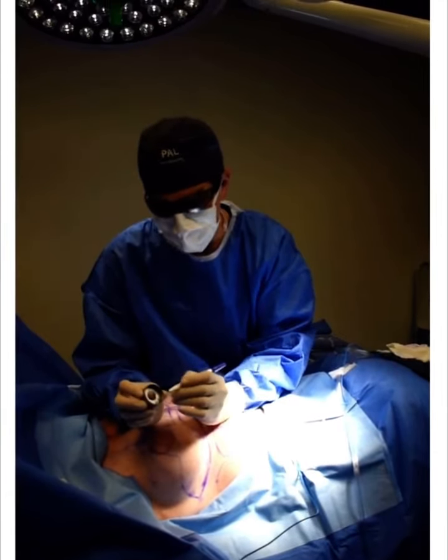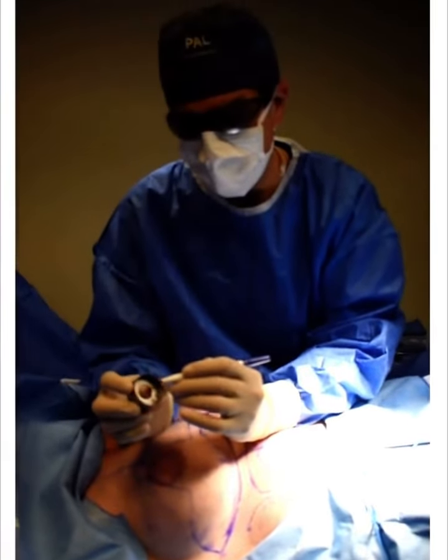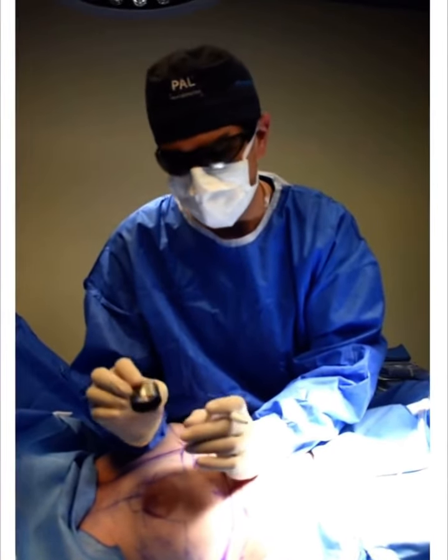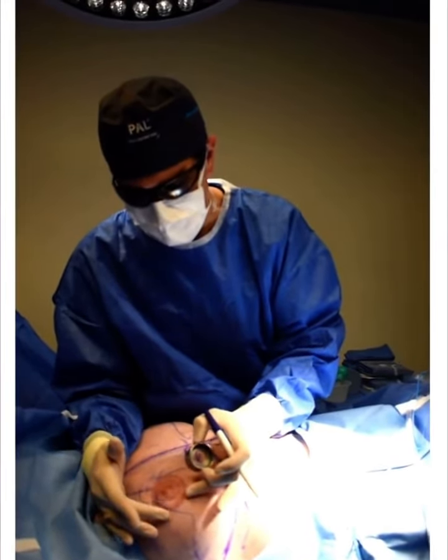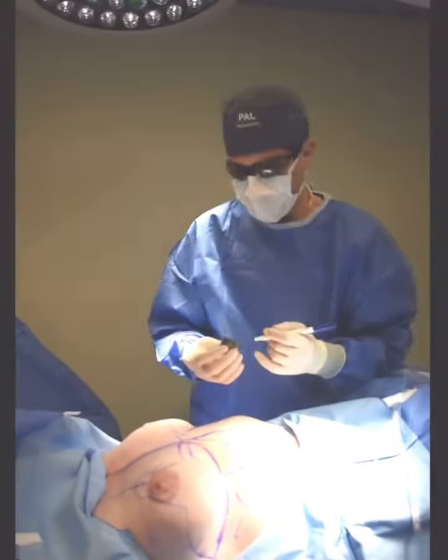What we have here is called a cookie cutter, and we're going to use this to mark the size of the areola — this will be the new reduced size. We apply it over here, and the areola is going to go from its current size to something much smaller.